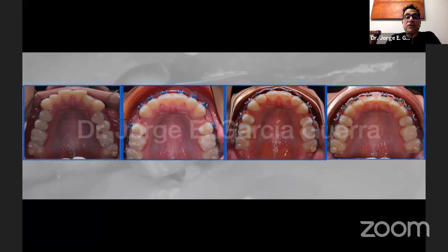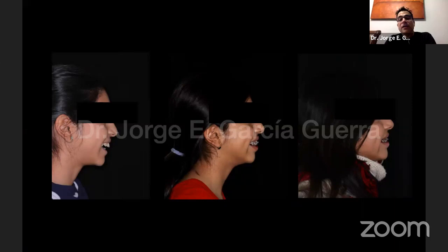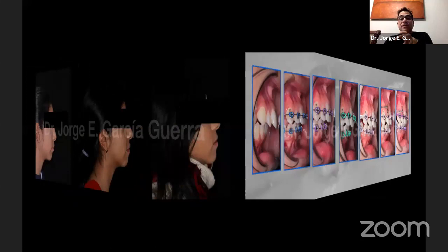And what we want to do is to maintain the position of the incisor. You can see at the beginning picture, they were very procline. So as we were closing the space, her profile was much, much better. Now, if you can imagine this patient, she was very petite, very short and with a very thin face. And she had a very beautiful smile, but her teeth were big, so they looked very protruding.